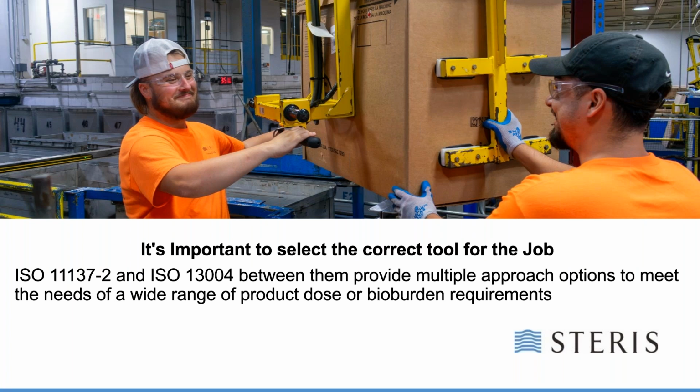So it's important to select the correct tool for the job. ISO 11137 Part 2 and ISO 13004, between them, provide multiple approach options to meet the needs of a wide range of product doses or bioburden requirements.